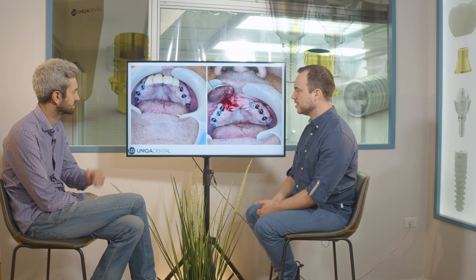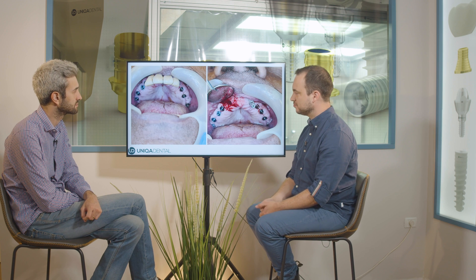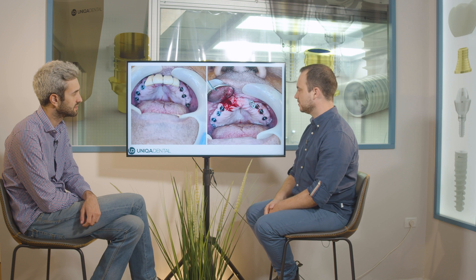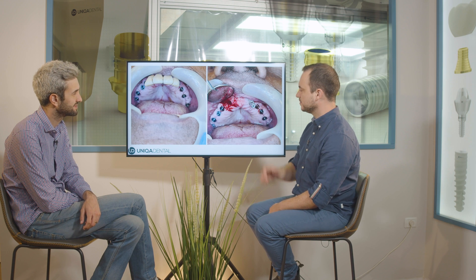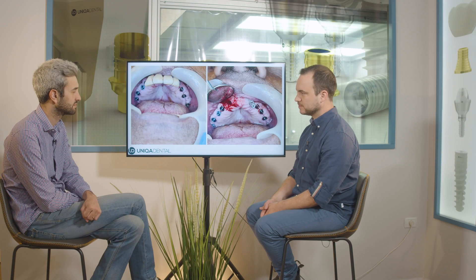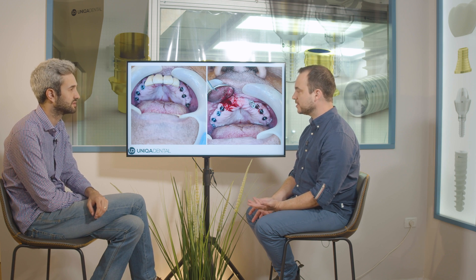When we took out the bridge, one of the implants just came out with it as easily as could be. The other one probably had its abutment remain — you can see the abutment still there with the cement on it. If the implant is fine, you can swap the abutment for another multi-unit and take another impression. The frontal implant on his right side just came out with the bridge, so you don't even need to extract it.